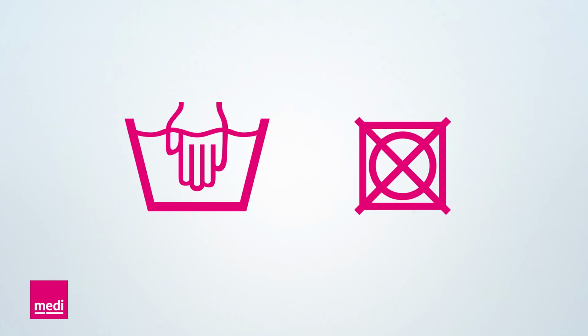The pad and covers can be washed by hand with cold water and a mild cleaning agent. Let the pad and cover air dry.